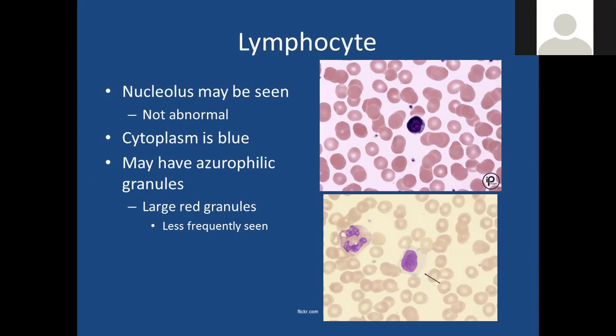They have special characteristics. They're lymphocytes, they have granules, they often have a ballerina skirt, okay? And that just means they've been stimulated. They are reactive. They're called atypical reactive lymphocytes. Some of our lymphocytes may have granules in them. It's not abnormal, okay? Unless you have about 50% of them, and then you might suspect infectious mono.